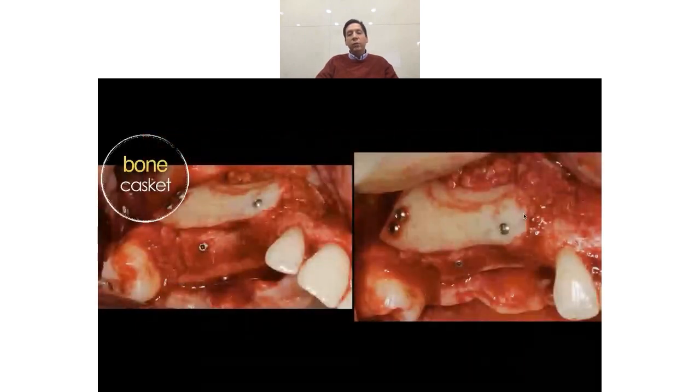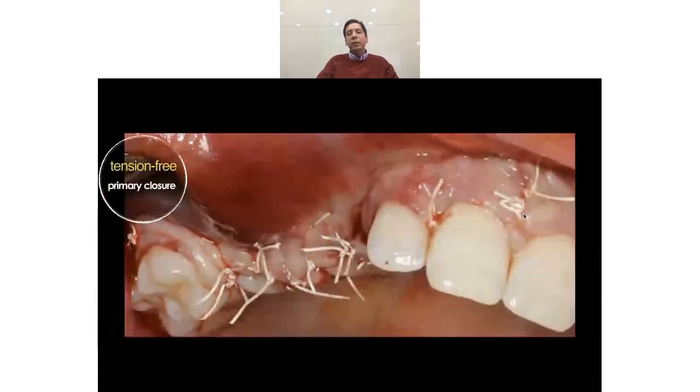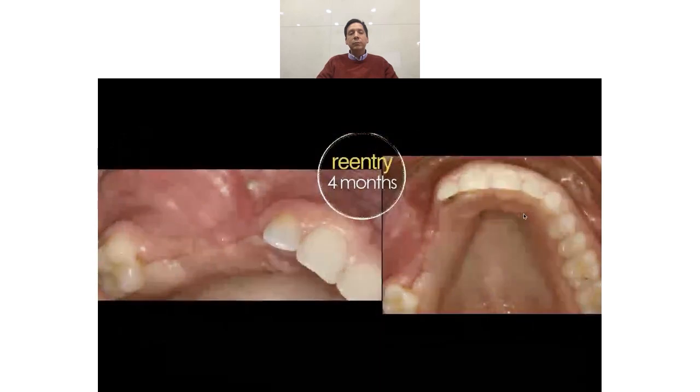This is a view of the final bone graft with the three blocks: buccal, palatal, and coronal. And then after releasing incisions on the periosteum, we obtain tension-free primary closure using mattress and interrupted sutures. This is the aspect 4 months later, when we're going to do the re-entry.